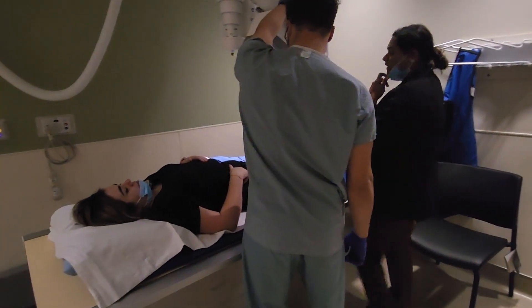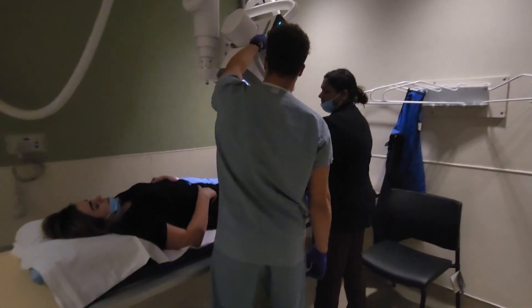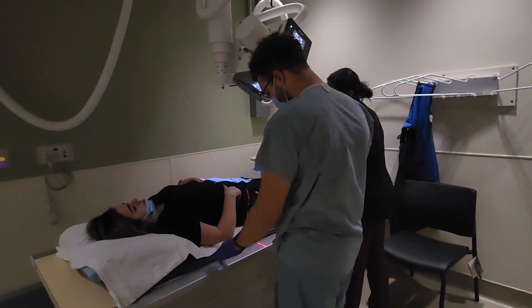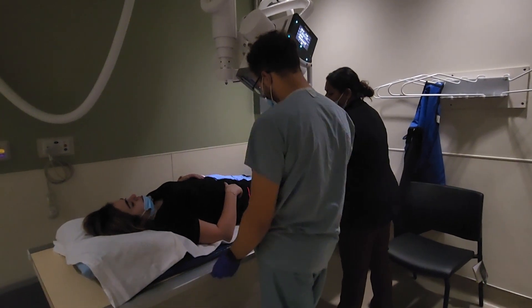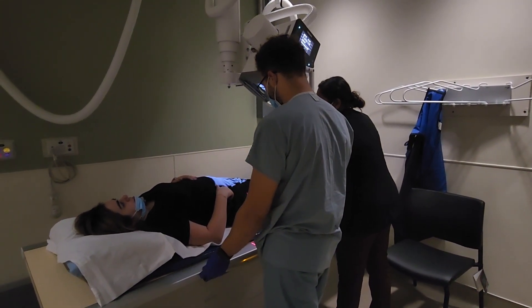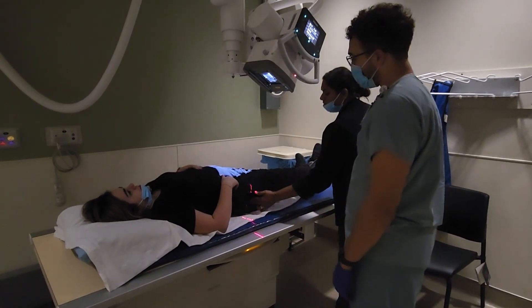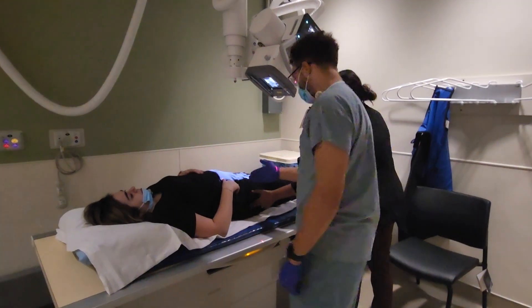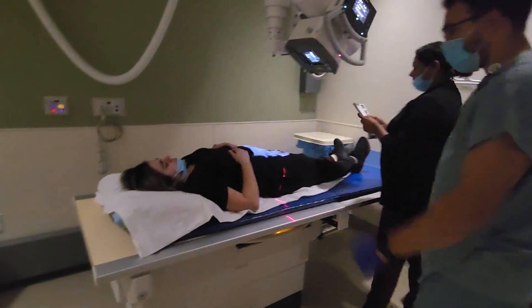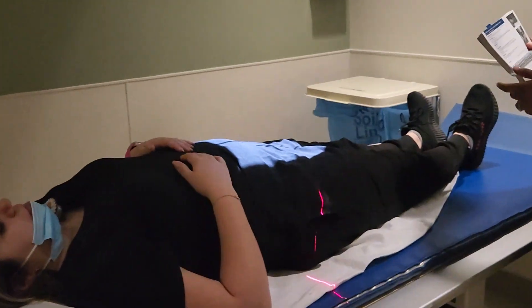So you can find the pubic symphysis how? By the trochanter. Turn your hip in and out for me — our trochanter is right there. Are we midline? We look midline. Perfect. Make sure our bucky is lined up with our laser.